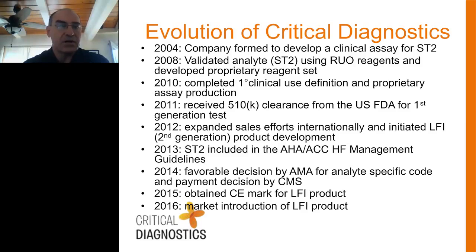a clinical use, and then we moved that into the regulatory process, obtaining our US FDA clearance for the test for our first generation test, which was an immunoassay based on an ELISA format, so an enzyme-linked immunoassay system, which is a fairly cumbersome multi-hour test, an immunoassay system that uses antibodies.